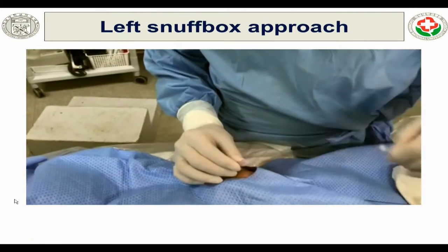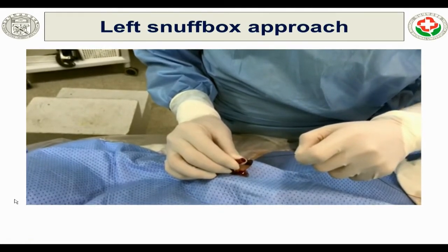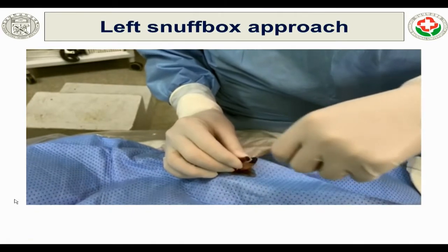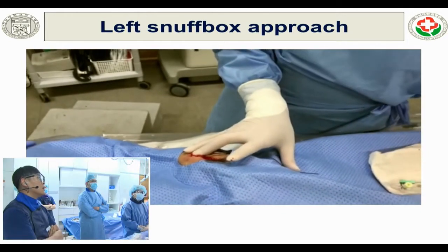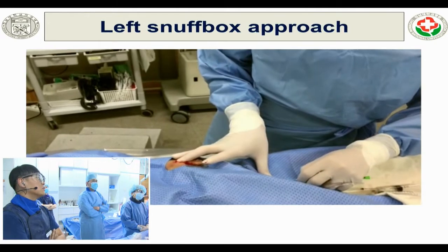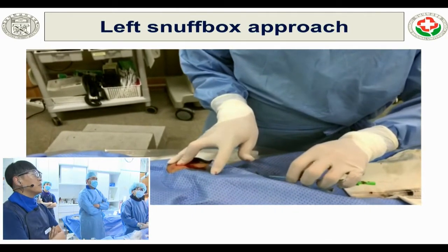Yes, I'm Yongchol Kim, and at CNUH we started the left snuffbox approach last November. We have done 150 patients via the left snuffbox approach for coronary angiogram and PCI. The snuffbox approach success rate is about 88%.